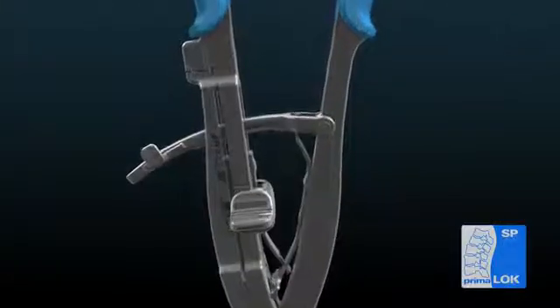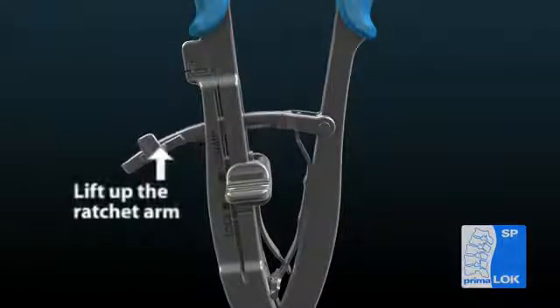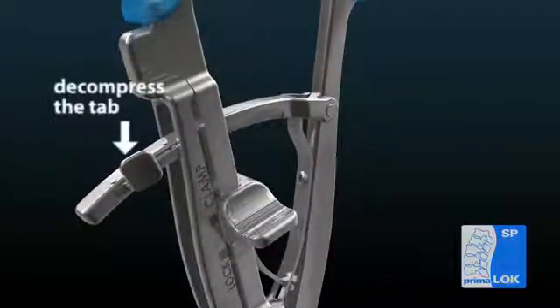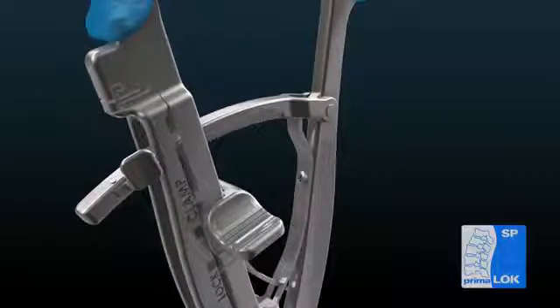Holding the implant inserter, make sure the slider tab on the inserter is in the clamp position. Open the distal jaws of the inserter by releasing the ratchet arm. Additional opening of the distal jaws can be achieved by depressing the tab on the ratchet arm.